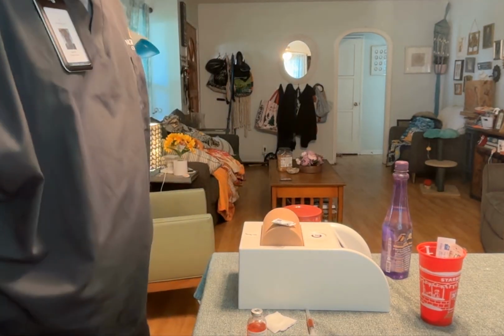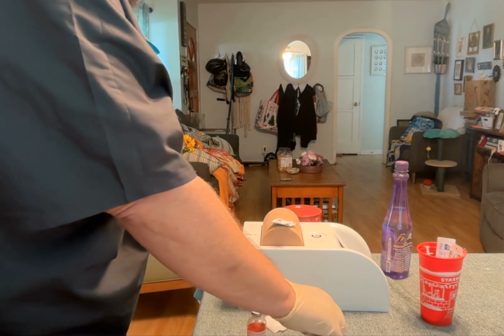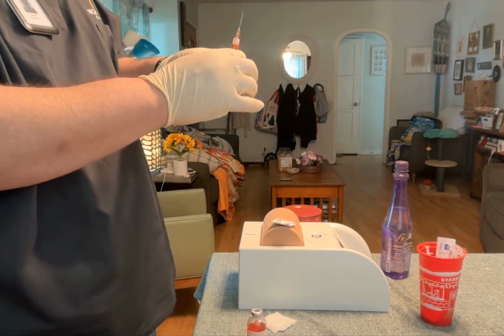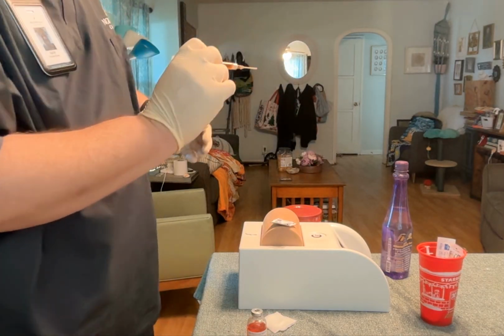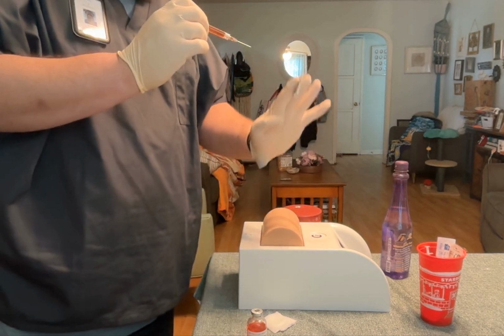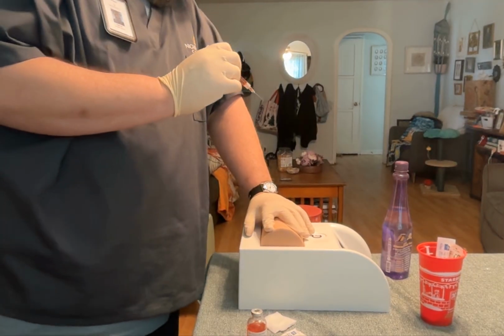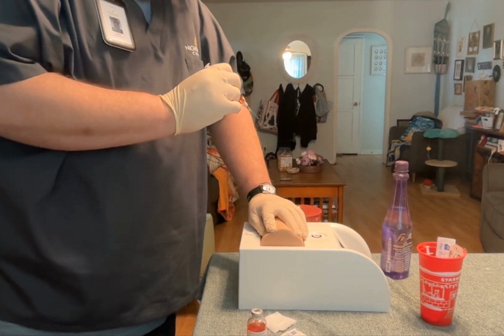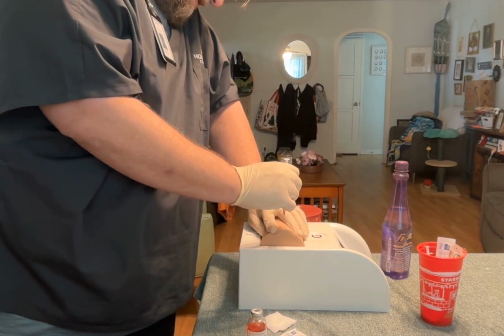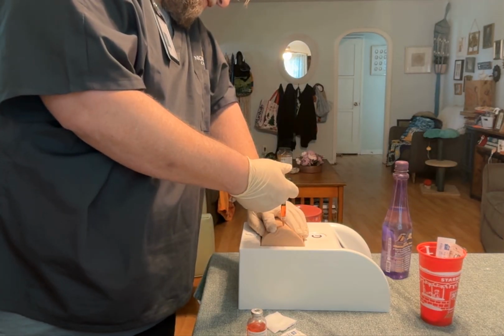I'm going to remove my hand and I'm going to take my medication. I'm going to take my cap off and we're going to do this at a 90-degree angle. I've now moved my alcohol, my marker. I'm spreading the skin taut and pinching a little, and I'm going to go in straight at 90 degrees. I'm going to inject my medication slowly over 10 seconds, starting now.